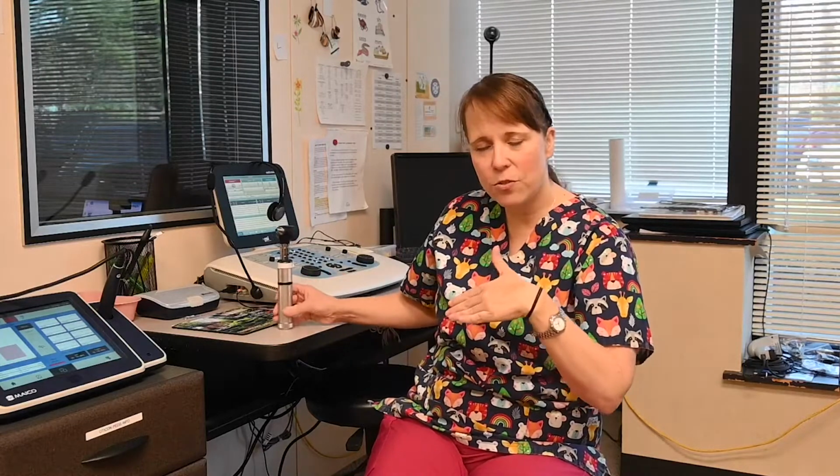The next thing I might do after I finish with otoscopy and looking at the child's ear is I often want to get a sense of how the middle ear system is working. And for that, I use a tympanometer, which is what this device is. For tympanometry, what we're doing is we're putting a probe up to the patient's ear, we're changing the pressure in the ear canal to try to get a sense of how well the eardrum is moving. For kids, this is really important because a lot of times when kids are having trouble hearing, it might be because they have fluid in their middle ear related to ear infections. It's one of the most common reasons that kids go to the pediatrician's office and why kids get referred to us here for an audiology exam.